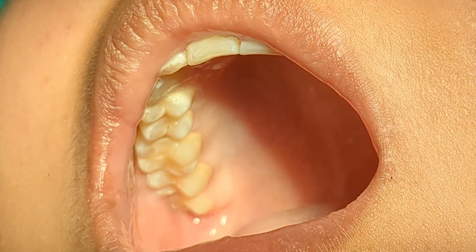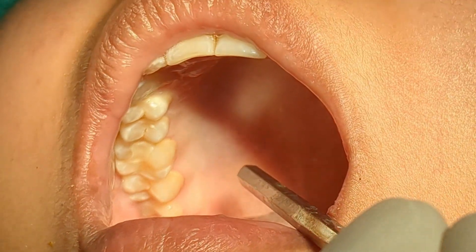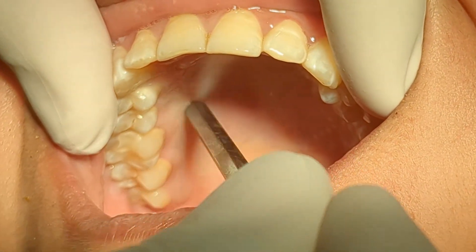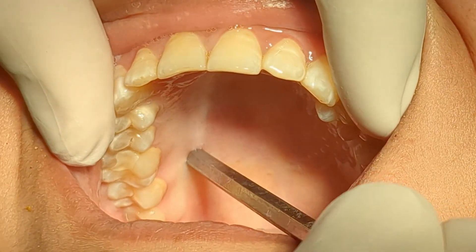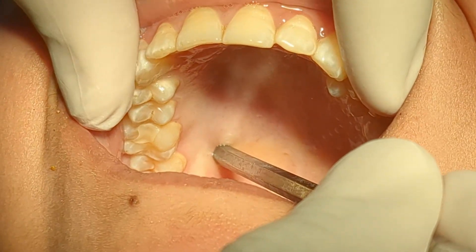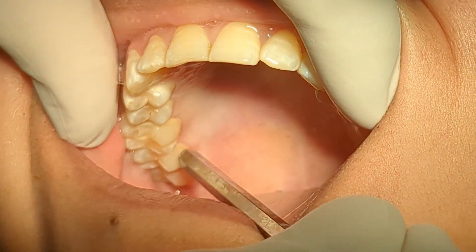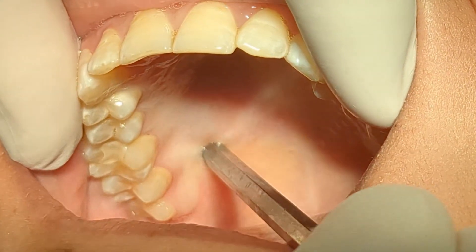For greater palatine nerve block, first we have to locate the greater palatine foramen. The foramen is located at the junction of alveolar bone and the palatine bone. I am going to start the palpation from the first molar and move back. I can feel a depression here. Most of the time this depression is located between the second and third molar, and we have the depression between the two at this point.